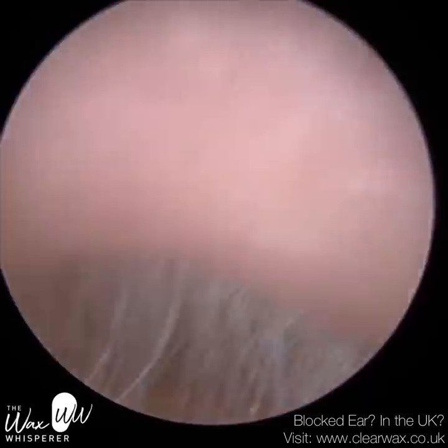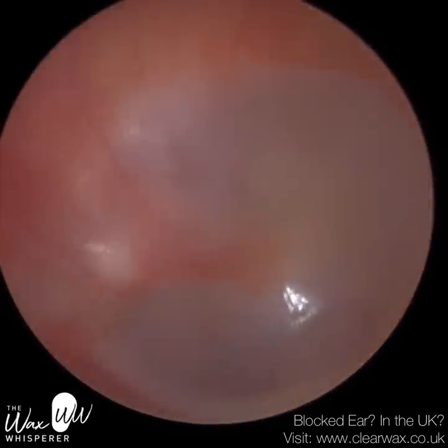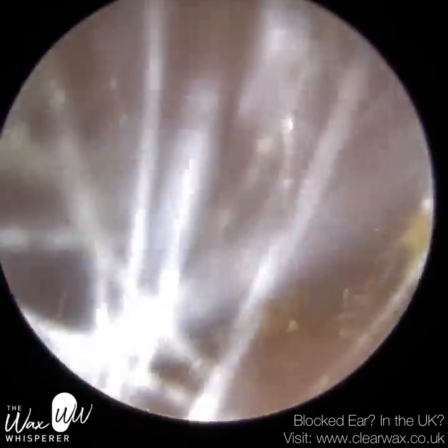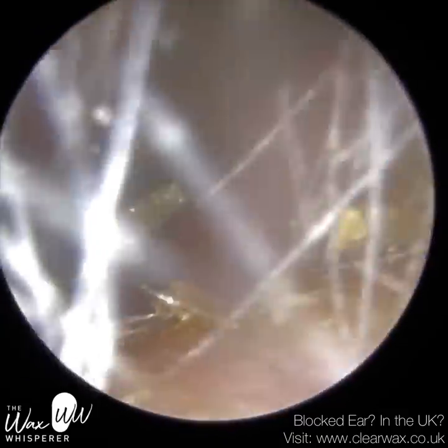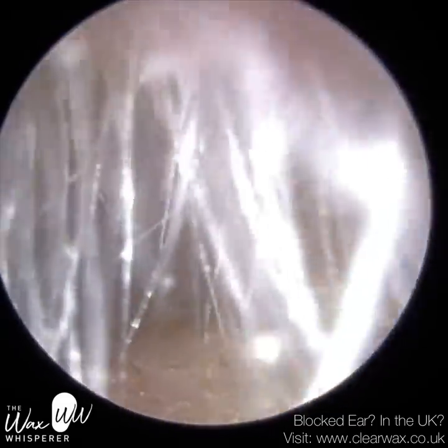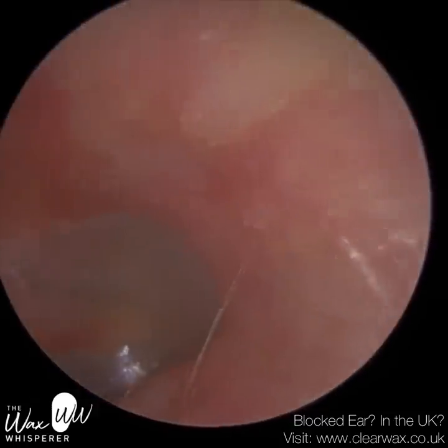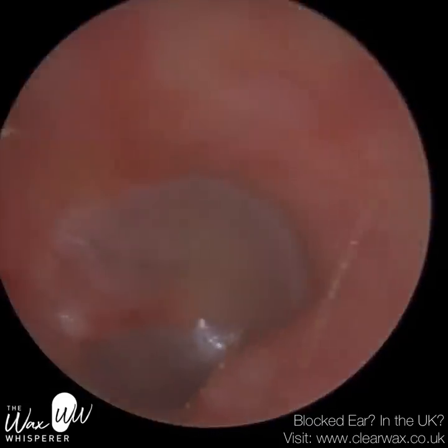That's that huge plug, and you'll see at the end there's still an image of the plug showing in great detail the sheets of dead skin. Once the skin dies and sheds, it should naturally migrate out of the ear in a conveyor belt motion. It takes around 10 months for skin originally on the eardrum — the outermost lateral layer of the eardrum is made up of the same skin that lines the inner two-thirds of the ear canal, the bony part. It's a layer of epithelial skin cells which forms the epidermis, the outer layer of skin.